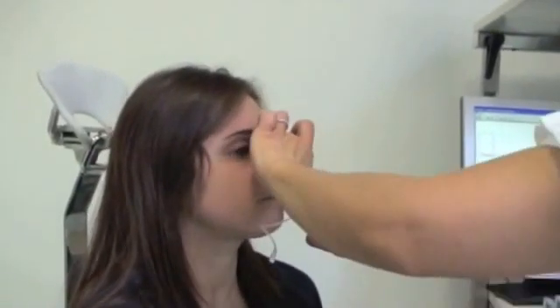After this, the other nasal cavity is examined and the seal of the patch is verified.